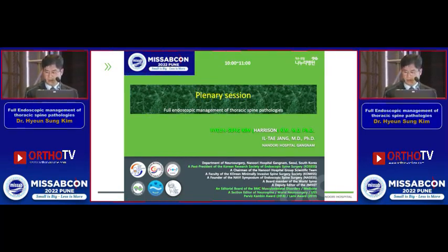This time, my lecture topic is the full endoscopic management of thoracic spine pathologies. Yesterday, I gave a talk about full endoscopic lumbar fusion, but actually, with full endoscopic lumbar fusion, the thoracic approach is the final hurdle to move from the gold standard of spine surgery to full endoscopic spine surgery. Because of that, this is a very important issue.